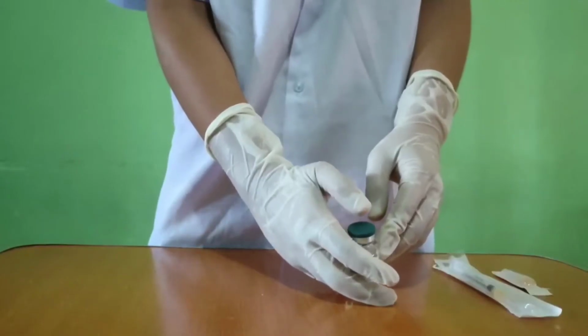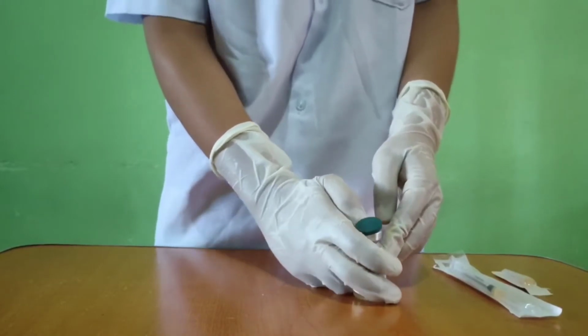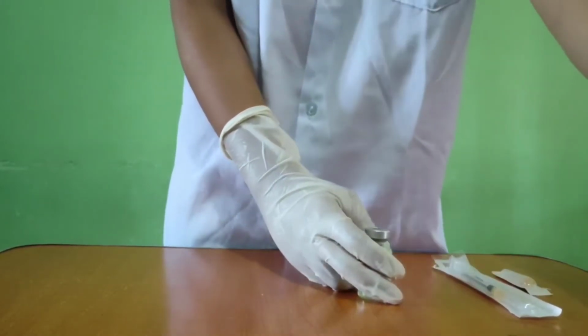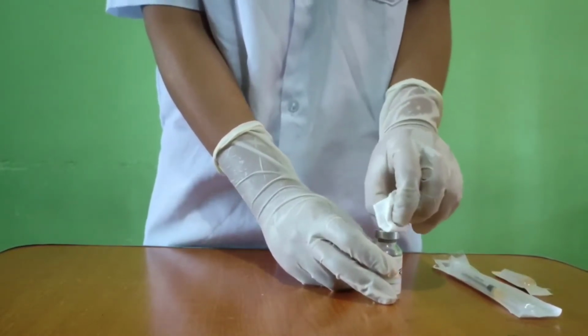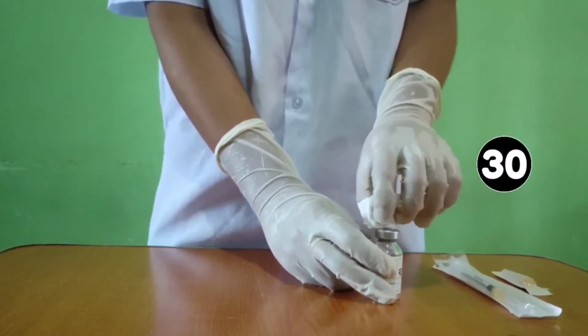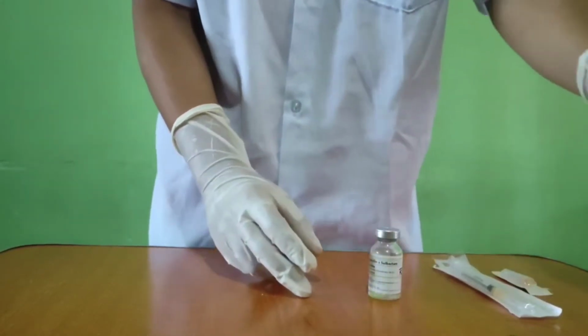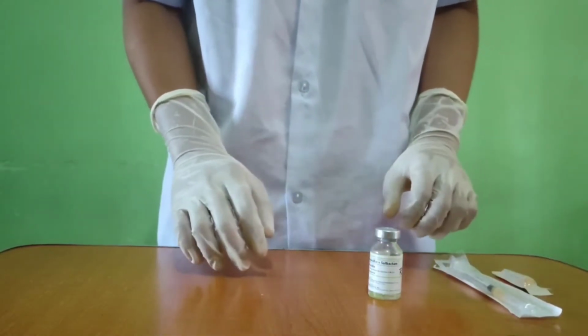Here, we're going to pop up the cap. After that, get a cotton swab and wipe it thoroughly in a circular motion for 30 seconds, and let's wait until it gets dry.